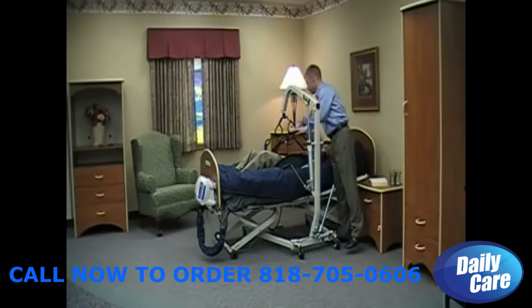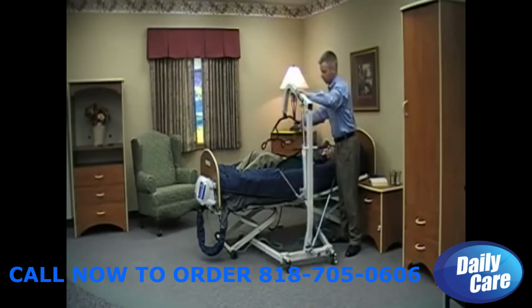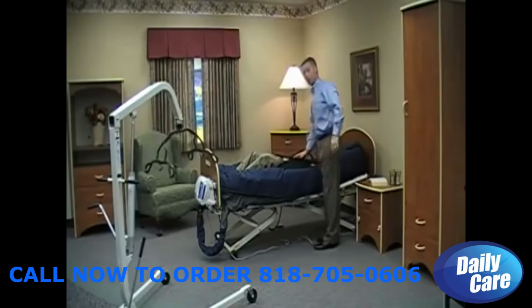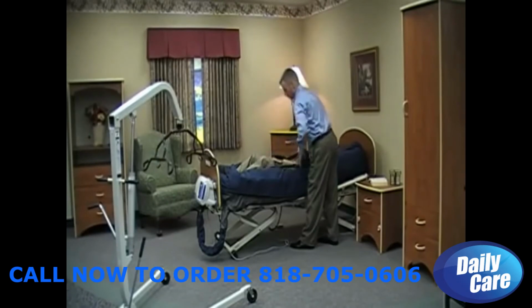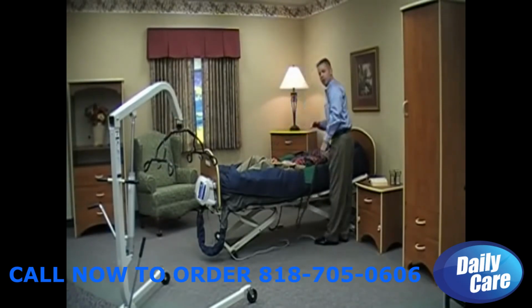And remove our sling straps. Remove our lifter quickly. And then begin to remove our straps. The way we remove the sling in the bed is simply the reverse of how we applied it, which is uncrossing the leg straps, drawing one side out, drawing the other side out, and then simply doing a log roll.